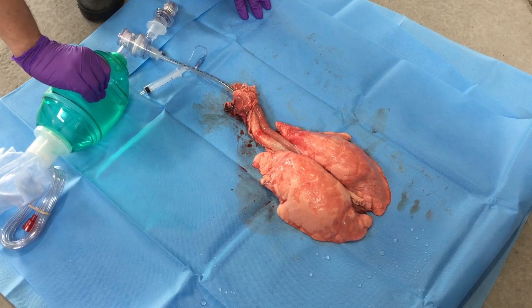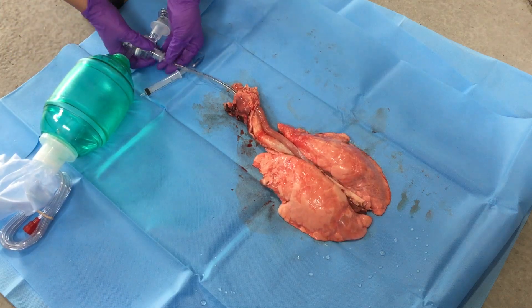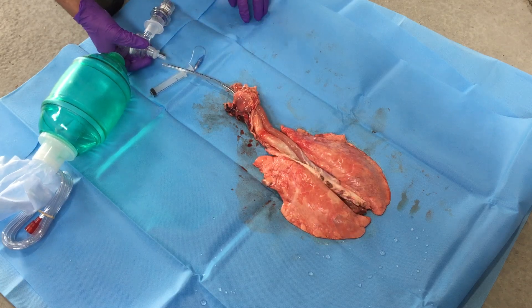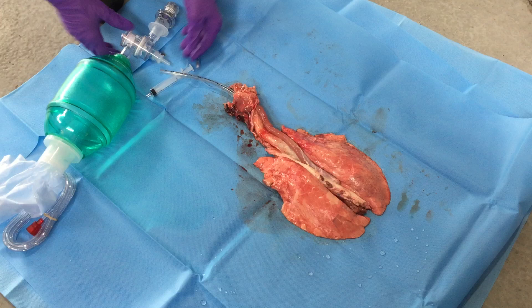Just to really see what that PEEP is doing for us — if we remove it, say we're taking someone off the vent to suction them, look what happens. We're going to have to recruit them all the way back up with that deflation.